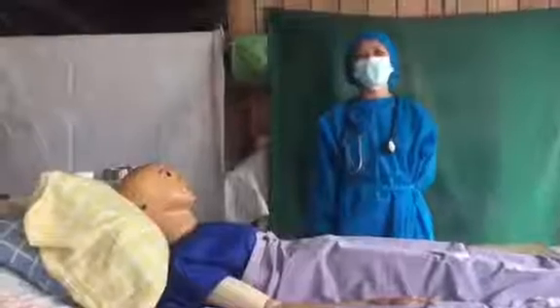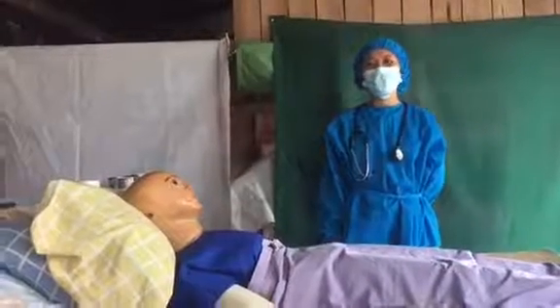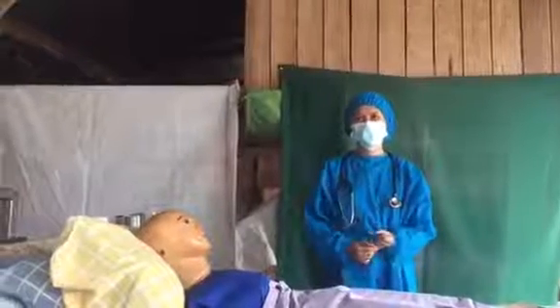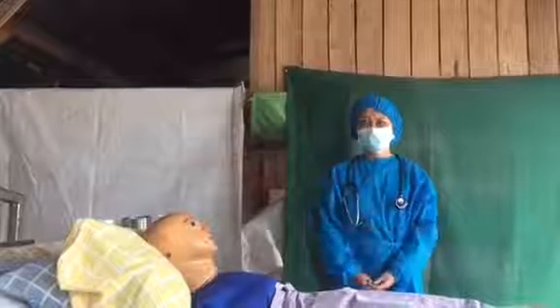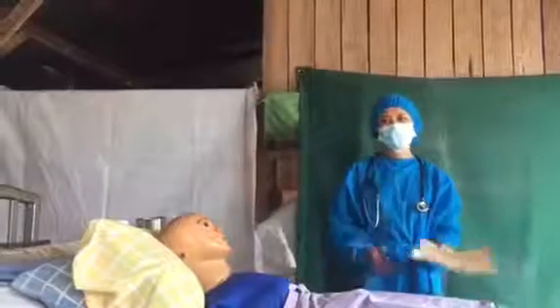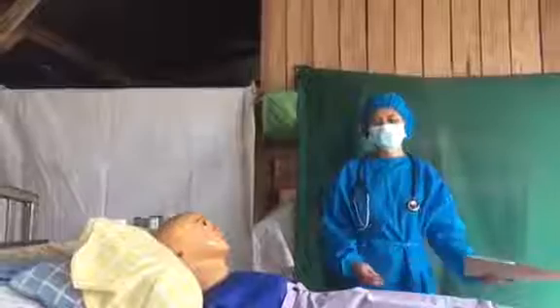Hi, I'm Shalami Tubio, and today I'm going to perform the procedure which is the nasogastric therapy. Okay, so before anything else, we should know the patient's data first, such as name, birthday, sex, civil status, address, and most importantly their vital signs. Next is to read the doctor's order about the patient's condition and the doctor's diagnosis to the patient.